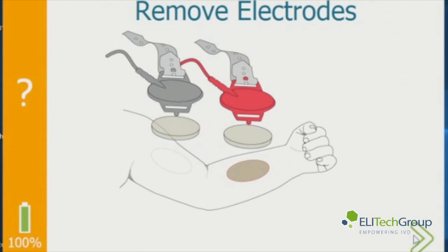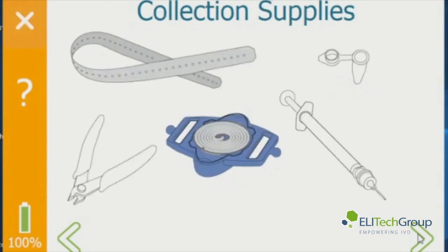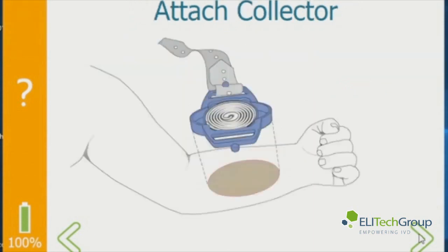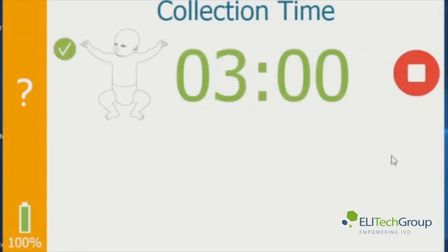Then it tells you to remove the electrodes and wipe the arm with DI water where the electrodes and Pylogel discs were placed. Your collection supplies needed are shown. You attach the collector where the red electrode was and you wait for sweat to appear in the tube. Hit the start button and this starts the collection time. The recommended time is 30 minutes. You can stop the timer anytime once the sweat has passed the two marks on the tubing, or before the sweat starts running out of the end of the final circle of tubing.